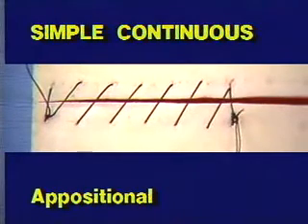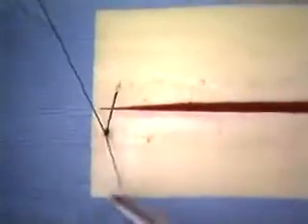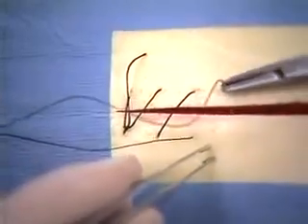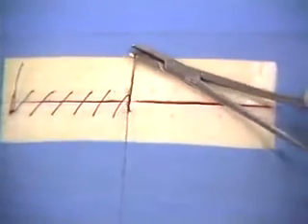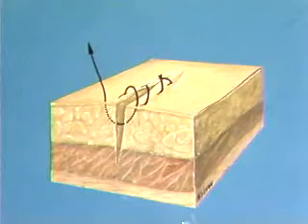The third pattern to be demonstrated is the simple continuous suture. This is an appositional suture pattern. It is made by first creating a simple interrupted suture and knotting, then only the short or non-needle end is cut short. The needle is advanced and introduced through the tissue perpendicular to the incision line, with no tying done as the suture is again advanced and reintroduced in the same way. At the end of the incision, the suture is knotted securely.